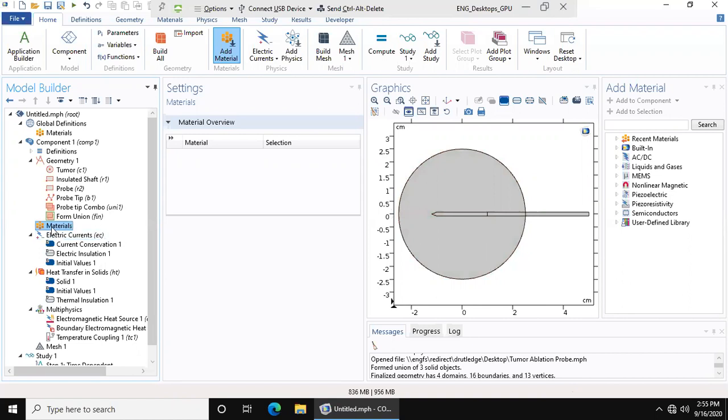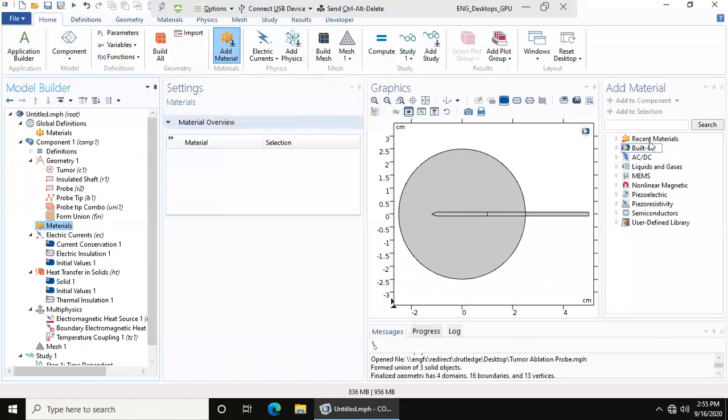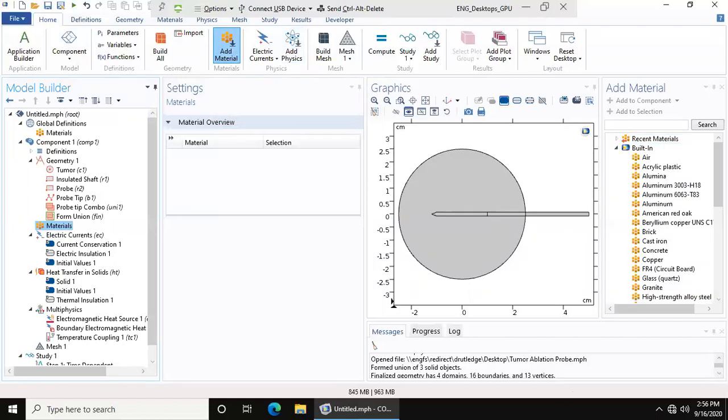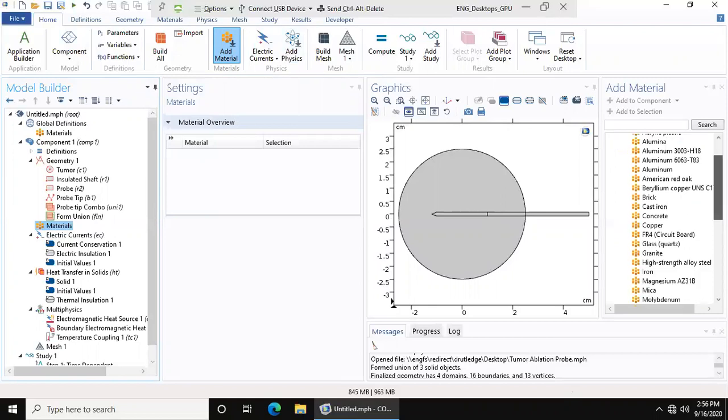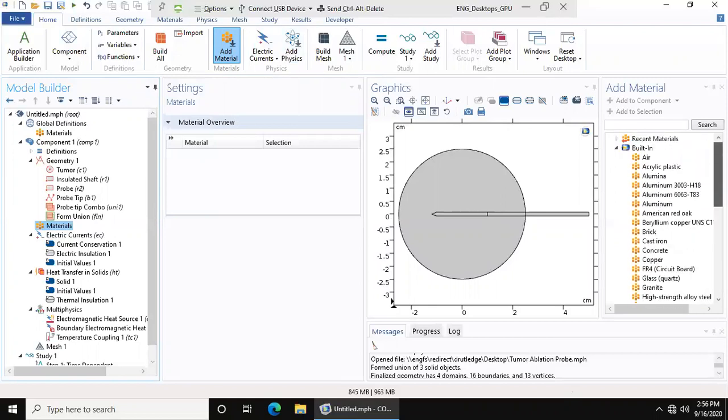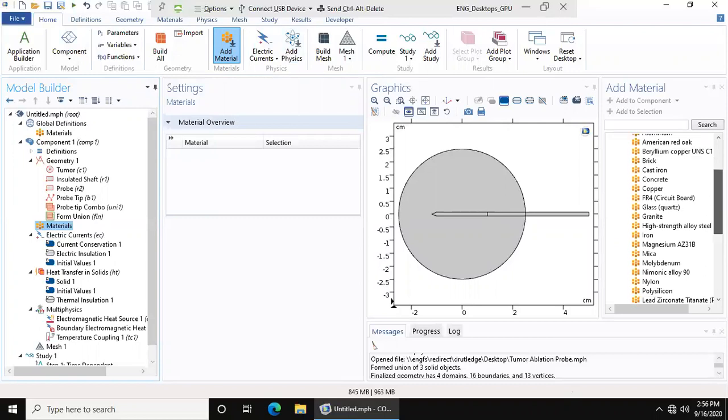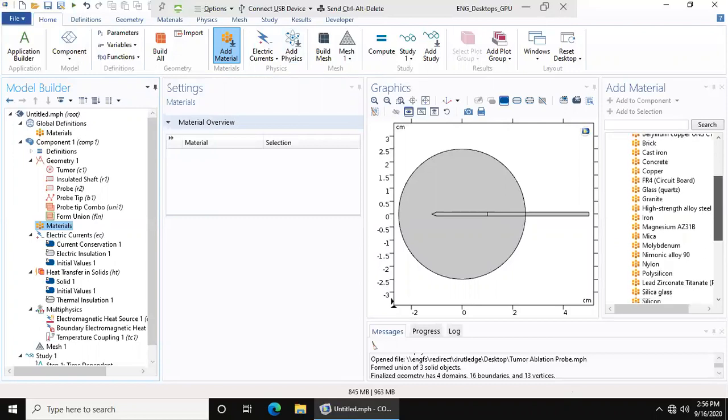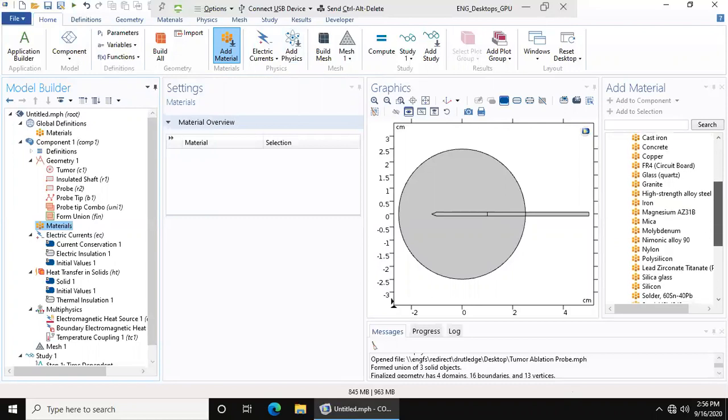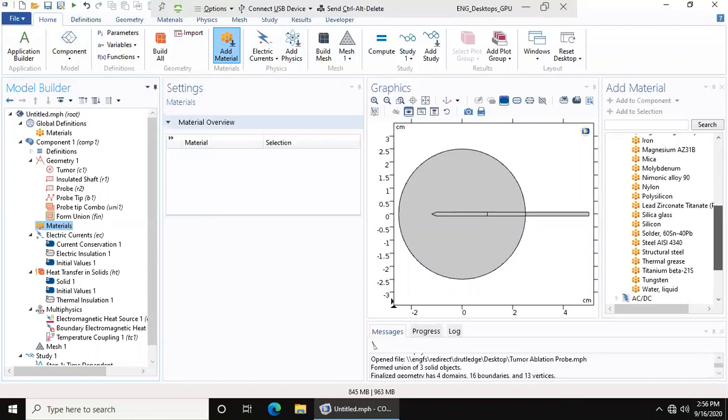If you click on the materials tab over here, you'll see that this add material is highlighted. You go all the way over here to the right and you get to choose your materials. It's pretty straightforward. The first material that we're going to add is for our insulating probe, and you can choose any insulating material.